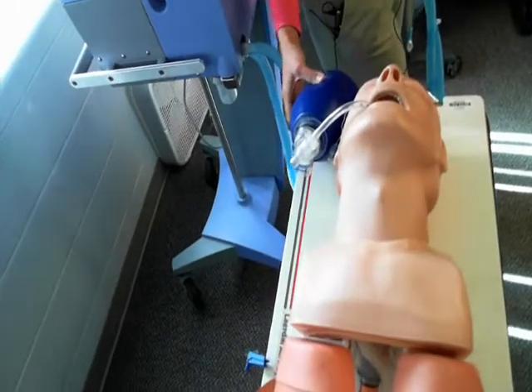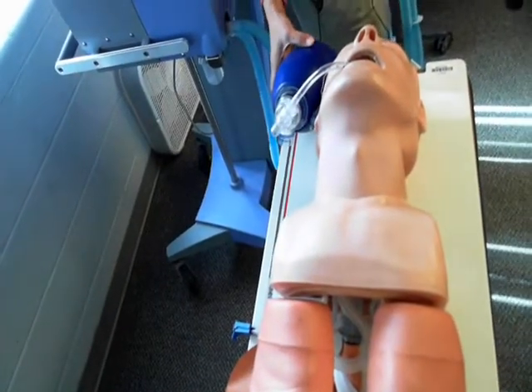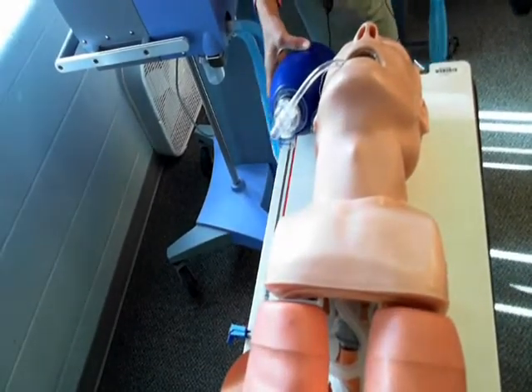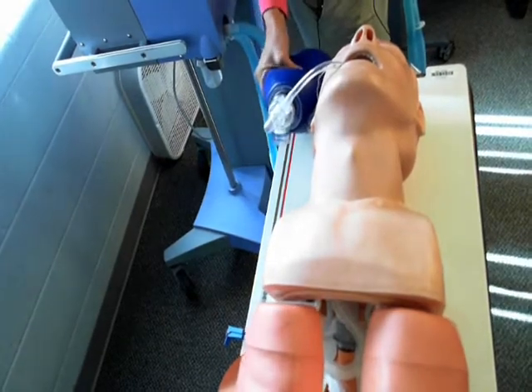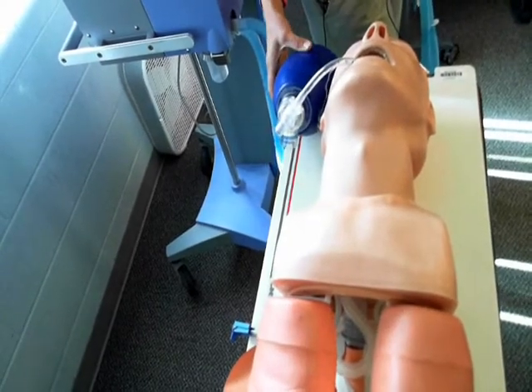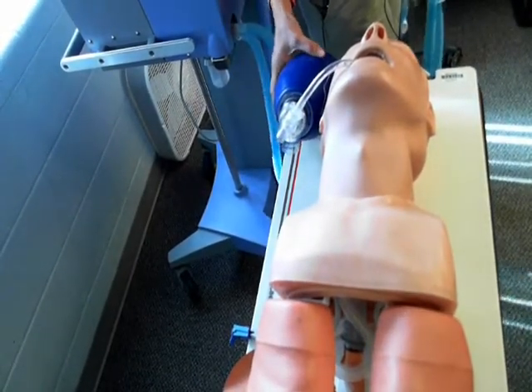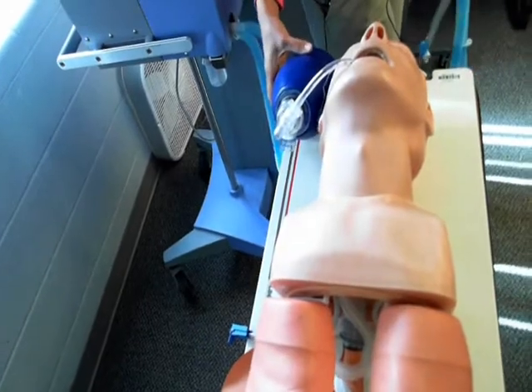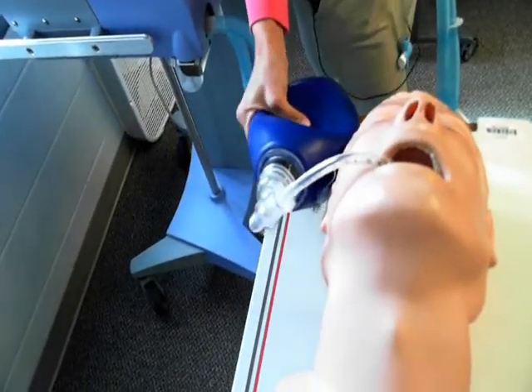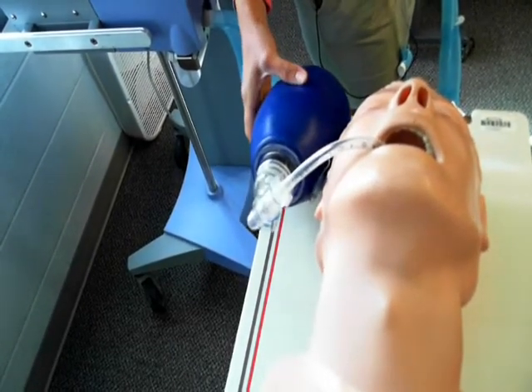On a critical care unit, you're never alone. But what is most important is you know how to stabilize that patient. It's not most important to me or to anyone else that you as the RN can run this vent better than anybody else. Pride has to go out the window. We have to maintain an airway and ventilate. As long as I can get oxygen in, I'm making them breathe, and if they're stable, that's all that matters, okay? So if all of this flies out of your head the first time you're on critical care, please remember, just assess your patient and bag them, okay? As long as your patient is okay, everything else can be dealt with. Does that make sense?